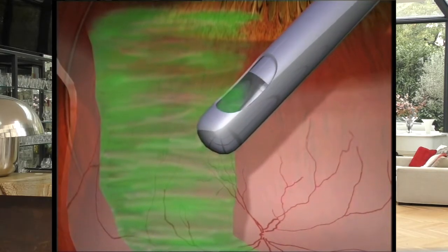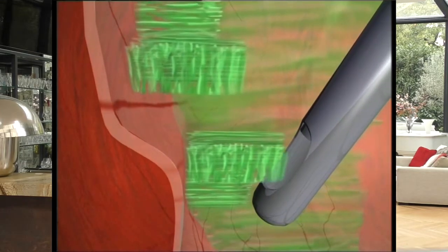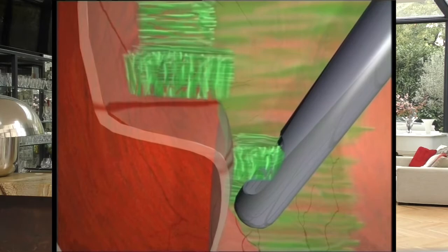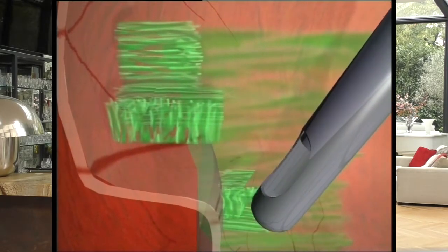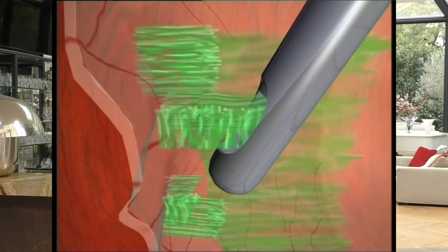It's no secret that if we want to remove more adherent vitreous, we must first make it come to the port by a low cutting frequency, and thus must also cause the retina to move. Then, to avoid retinal damage, we must control the aspiration flow.